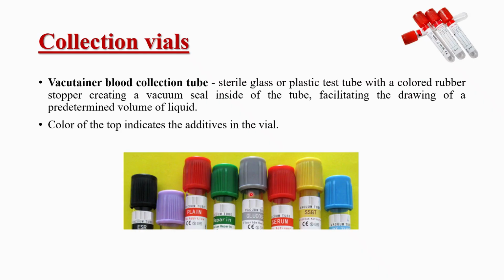The color of the tube cap is not decorative. It indicates the specific additive present inside the vial, such as anticoagulants, clot activators, or preservatives. Choosing the correct tube is essential to ensure accurate laboratory test results and proper sample handling.